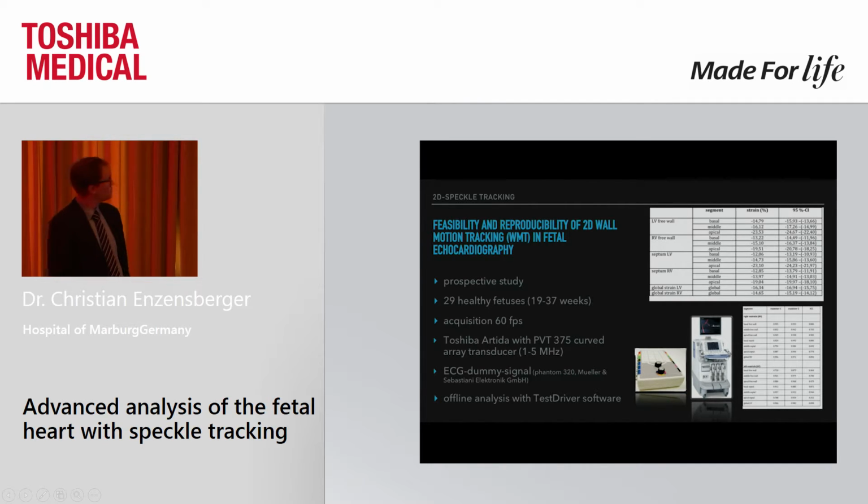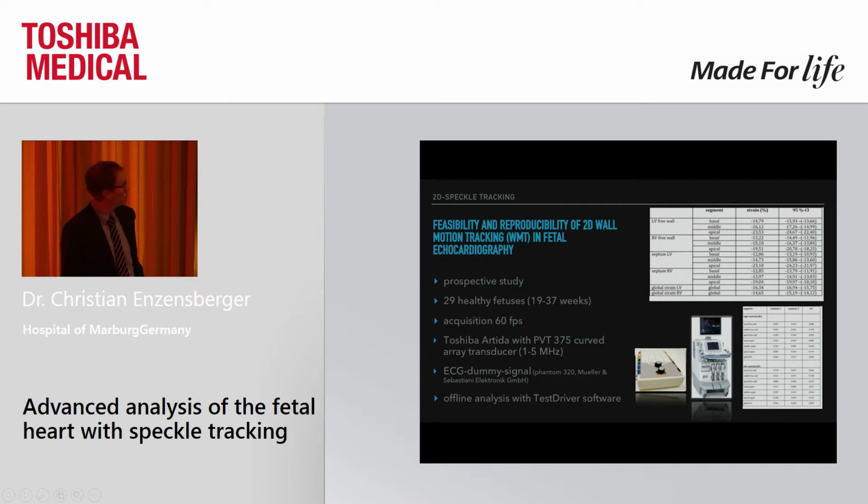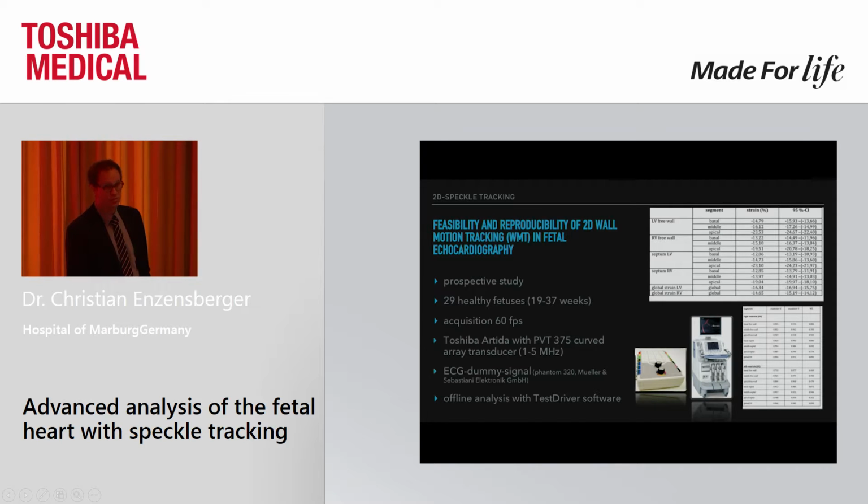One of the first things was that we know it's a very new technique, and first of all, you have to see how is the reproducibility and feasibility. Therefore, we performed a prospective study. We included, in this case, 29 healthy fetuses. For the acquisition rate, we chose the doubled DICOM rate, in this case 60 frames per second.